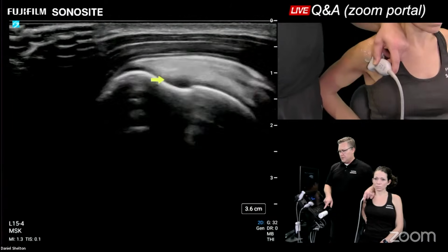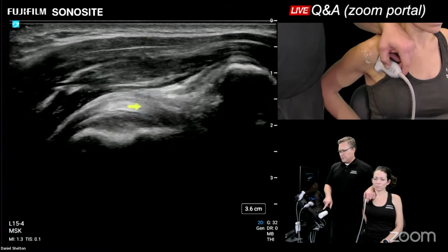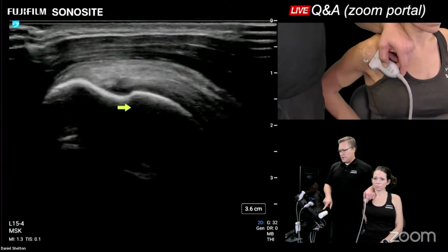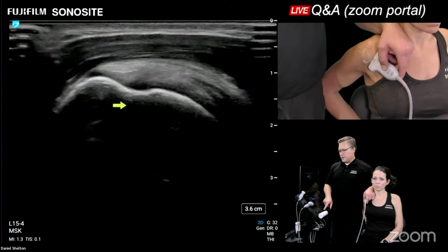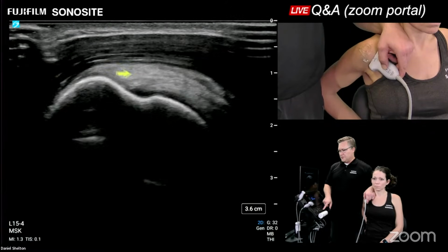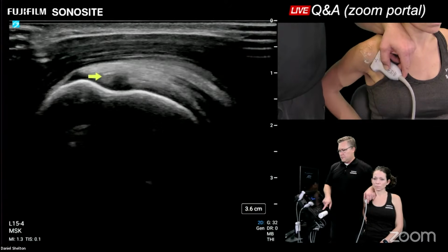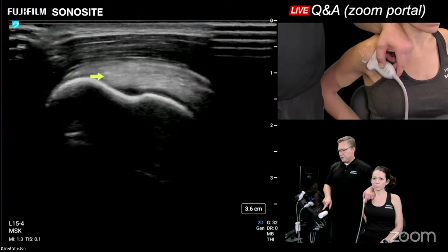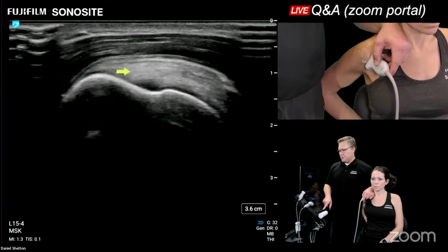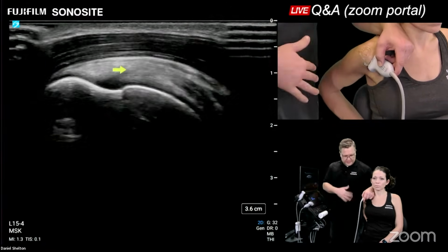So I have them relax. I go check the most anterior portion till I see the biceps. So here's our biceps, intra-articular, slightly lateral here. And then I'll have her do that again. So I just have her press up against my hip with her elbow. And you can see the fibers, they did change their shape a little because they're under a load. And then relax. There. And then maybe one more time as I go through another posterior third of the fibers. Go ahead and push. There you go. And relax. So I do that especially for dynamic study.